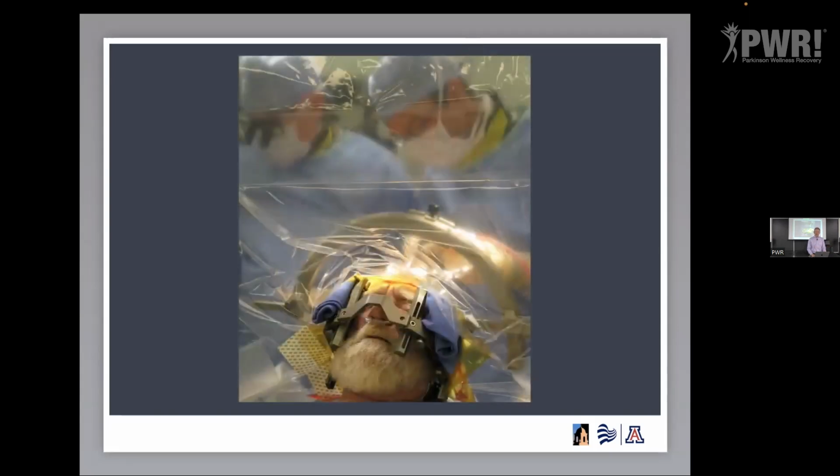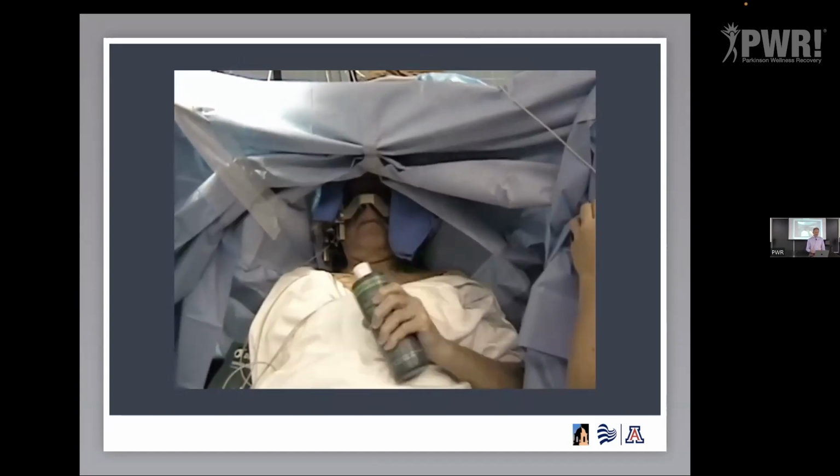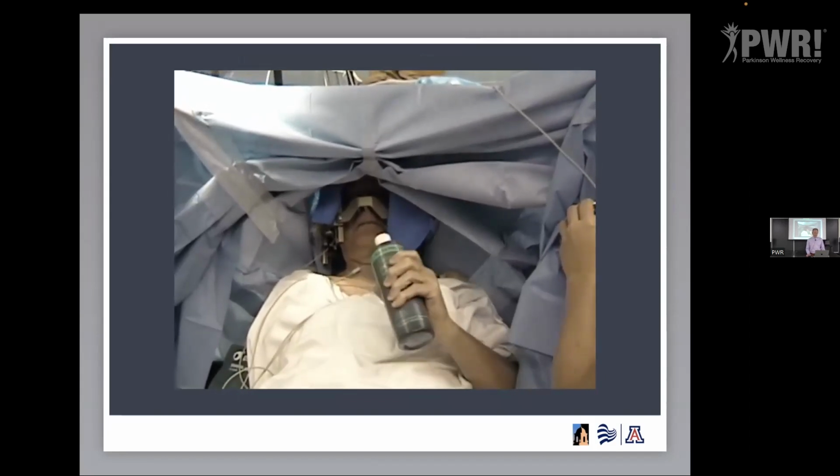Now, if you've heard about DBS or been on the internet, you've probably seen videos of patients having this operation where they're awake during the procedure. And we actually used to do it that way. There are still some centers around the country that do what we call awake surgery. This was necessary because we're trying to get this electrode into a really specific spot and we can't see inside your head in the operating room. So we would have patients awake so we could put the electrode in, turn it on, and check the responses, see if symptoms got better or see if you were having side effects. And we needed patients to give us feedback. Here's an example of a patient that's got really bad tremor.